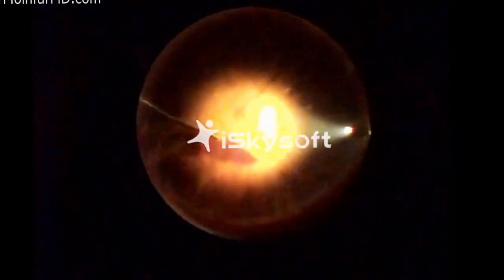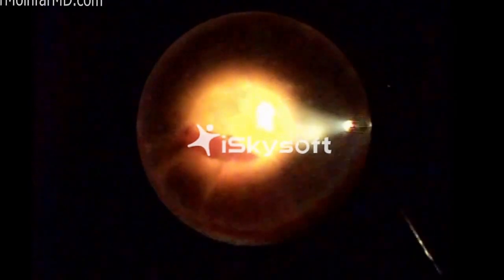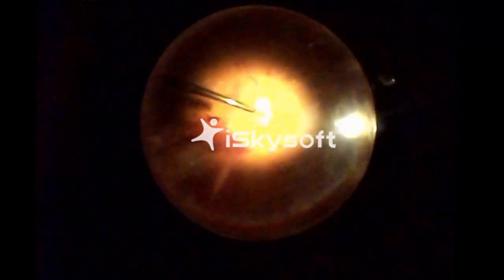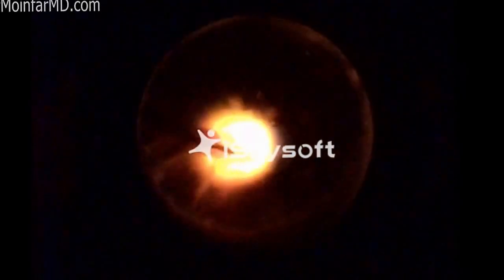Quite often, as you'll see in this case as well, it's helpful to use the assistance of various dyes or chemicals to help stain and identify the vitreous. You'll see in a few moments that I'll be injecting some cortisone inside the eye that allows me to better identify the vitreous and to identify the strong areas of adhesion between the jelly of the eye and the retina.